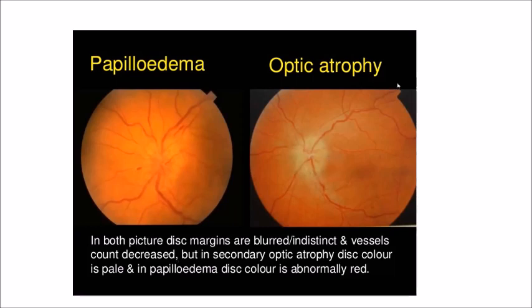Consecutive? Is there any retinal disease or retinal vascular disease? No, sir. So then it is primary. Yeah. So it is not consecutive. Is the margin blurred?